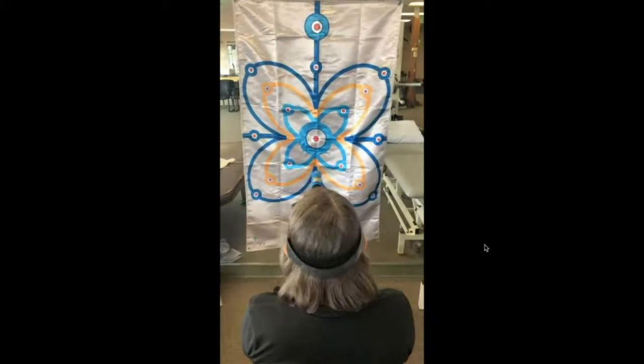Just mildly. So that gives us a baseline that we can share with her and say, hey, we're seeing these things. Let's not worry about the bouncing for right now, but let's see if we can do some things to train you to have more of a center equal excursion during your VOR.